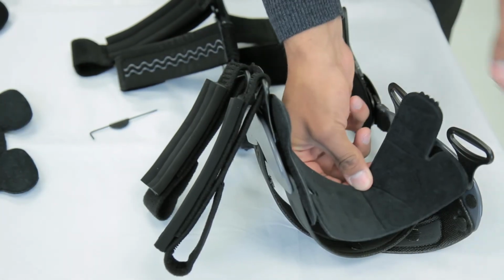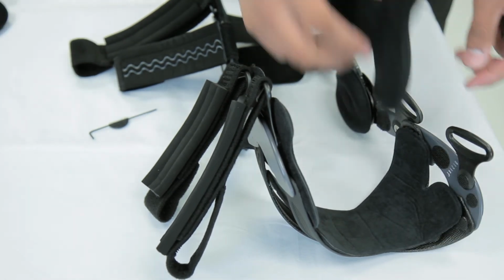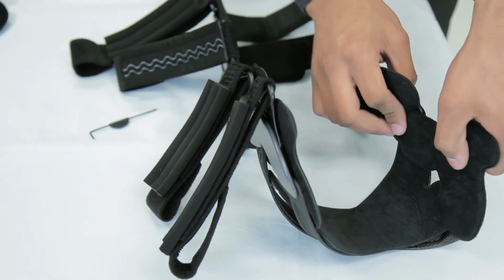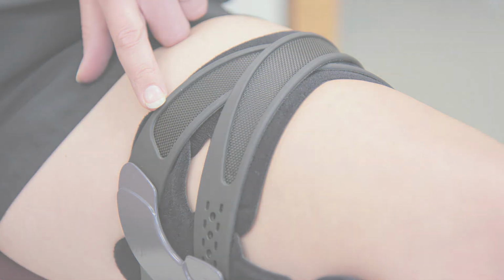Replace the liners. If the end of the ATC strap extends past the frame, it can be trimmed with scissors. Have the patient put the brace back on and check to see that the ATC now sits flat against the thigh. If not, tighten down one more notch of the strap.